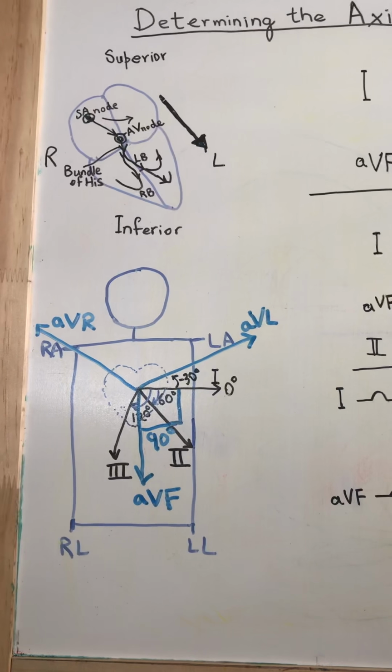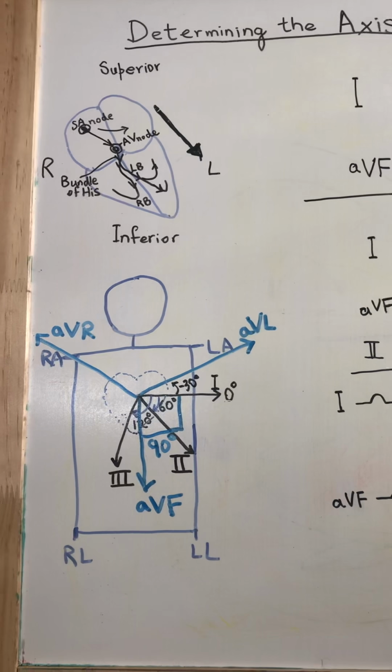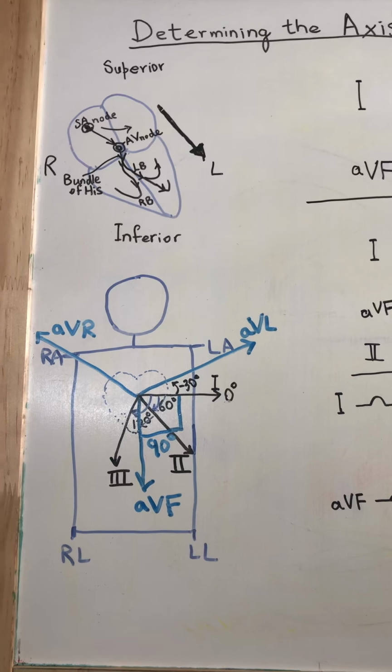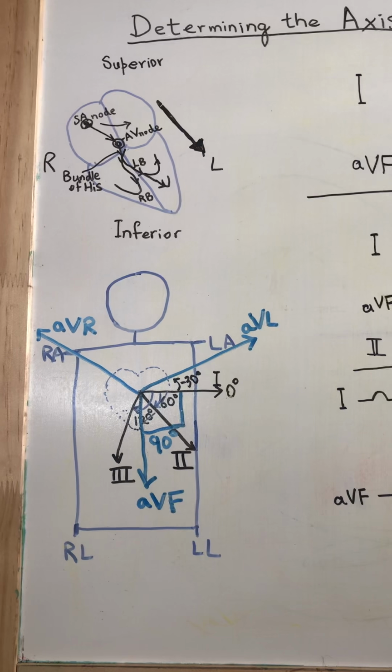In this video, we will briefly discuss how we can determine the axis of the heart using EKG. Before going to discuss the EKG for determining the axis of the heart, let's review a few basic facts about the conduction system of the heart.